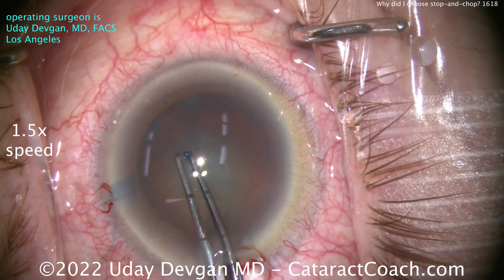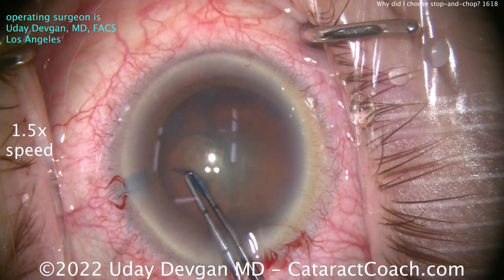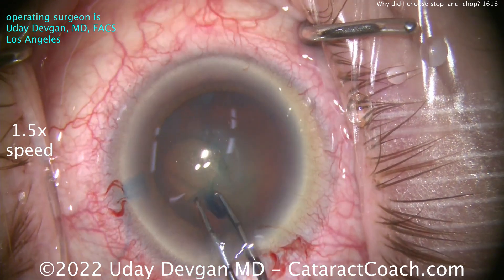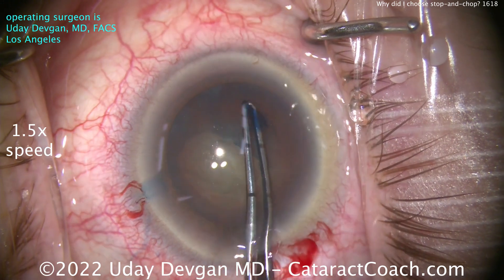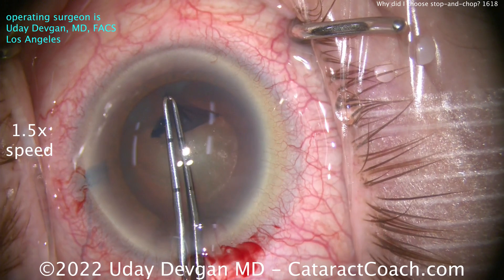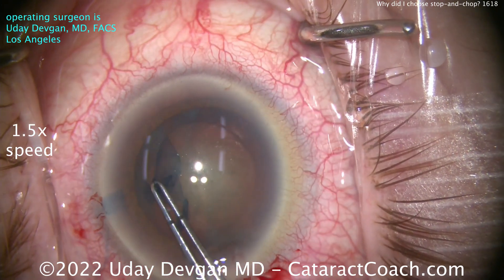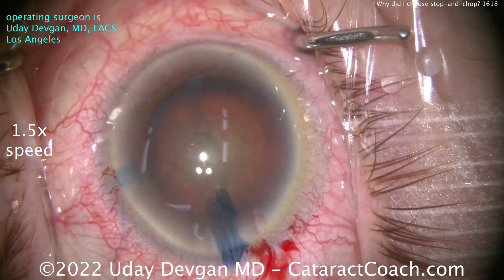Let's get our REXs done. Now we're looking at the lens capsule — not too much wrinkling. I'm measuring there, getting an idea of how big I want this REXs. I want to have a good overlap, so we're going to do a 5 millimeter REXs here. The patient has a very thick lens; the anterior-posterior dimension, the lens thickness, is almost coming on 5 millimeters thick.